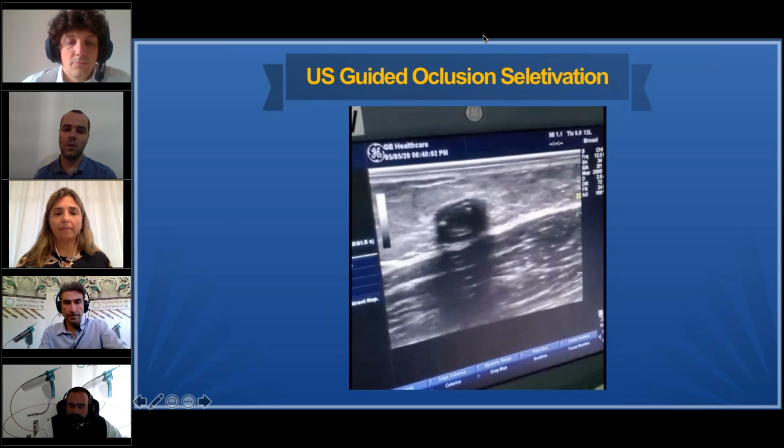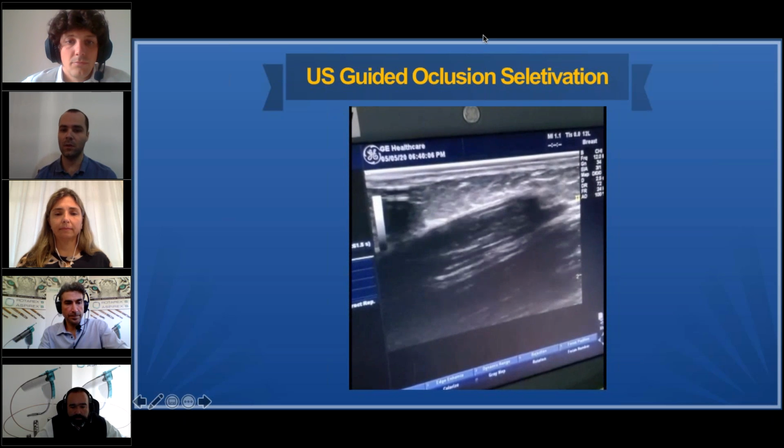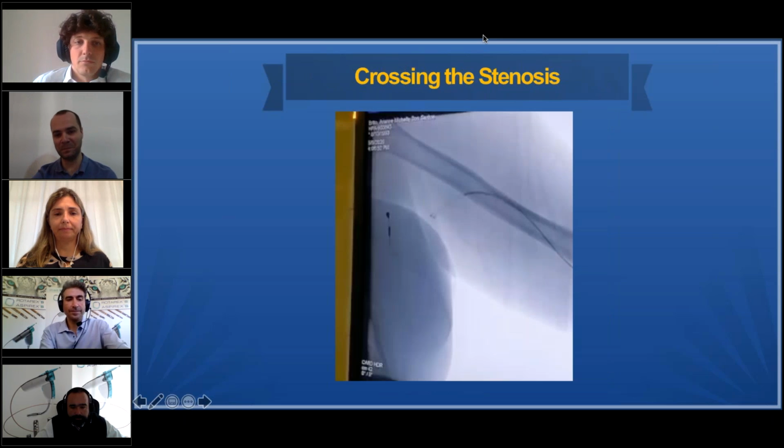In the image, you can see everything with the ultrasound. You can even do the whole procedure with the ultrasound, and it is better for our radiation exposure.